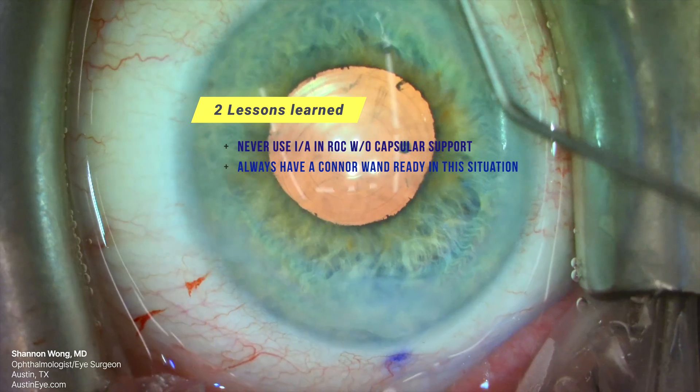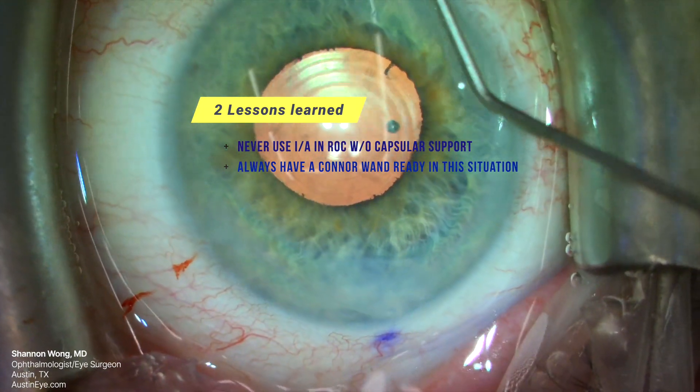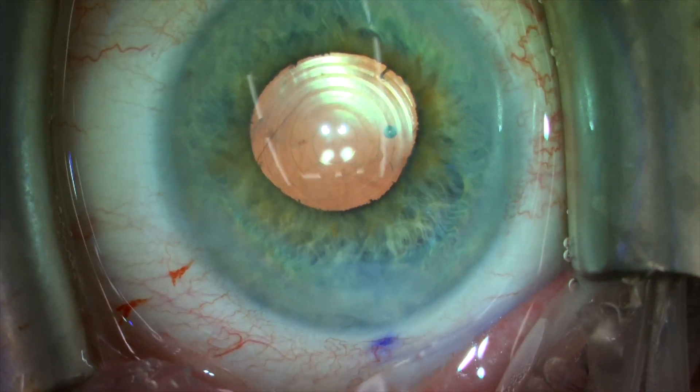Number two: the Conor wand is to a cataract surgeon like a lightsaber is to a Jedi. Next time, try not to lose it. As the saying goes: 'This weapon is your life. It can save you. Have it ready at all times.'